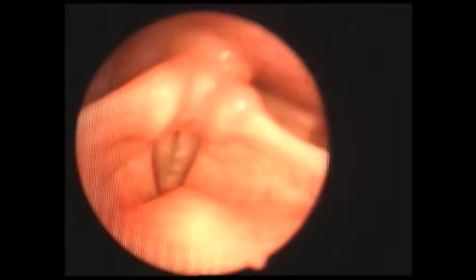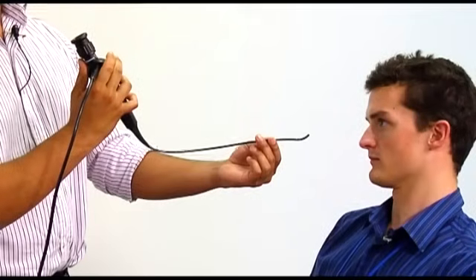The vocal cords can be assessed with the patient talking, or even singing. Nasoendoscopy concludes the examination of the nose. The sense of smell can also be tested if necessary.